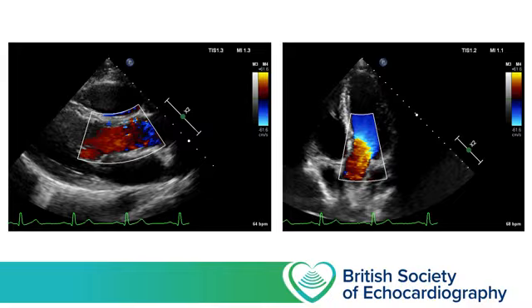So in our parasternal long axis, the ultrasound machine has demonstrated the blood in the outflow tract is moving very slowly, using only shades of very dark red, whereas in our apical 5-chamber view, where the blood is moving away from the probe, and therefore should be demonstrated with shades of blue, we've got aliasing occurring long before the outflow tract, as the blood passing through here has already exceeded the maximum that the scale allows.